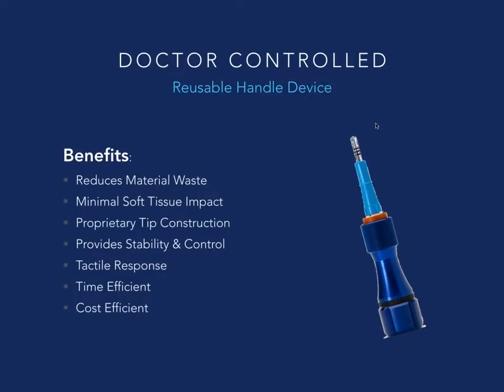So you can see those 3 rings there. I believe they're 3, 5, and 7 millimeters, so you can get that gauge. You can get this without those rings, and as you get more comfortable, I think it's nice to use that device without the rings, to just get that tactile feedback in your hand and your wrist as you spin that into the cortical bone.